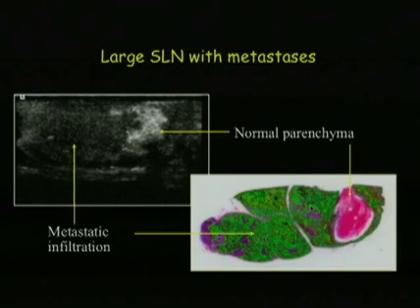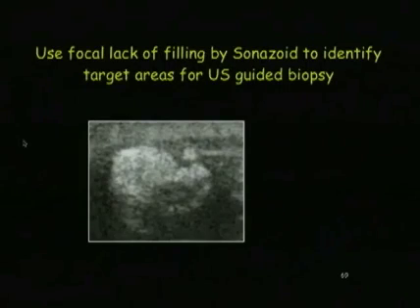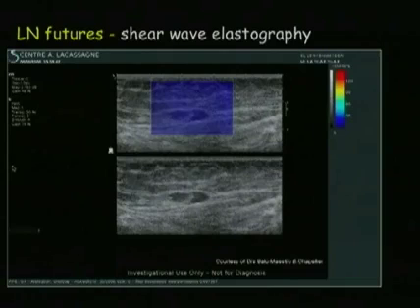Now, in a lymph node this abnormal, contrast wouldn't help us because we would know this is metastatic disease and we would specifically target this. But there are many cases where the metastasis is rather small, and there's a lot of normal or even reactive cortex in that lymph node, and were we to target this part or this part of the lymph node, we would get a false negative biopsy. So what this is going to allow us to do is target our FNA or core biopsy specifically to the area of decreased enhancement. And I think this will improve our ability to distinguish reactive from metastatic lymph nodes.